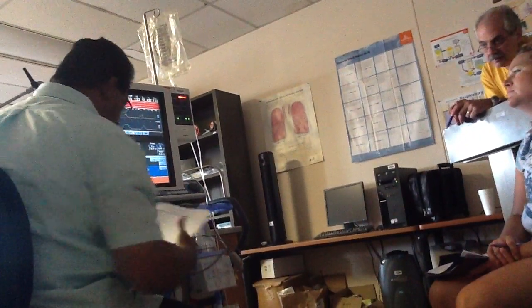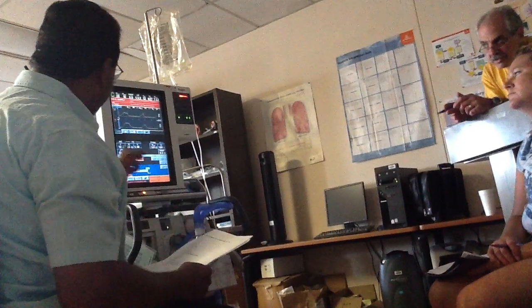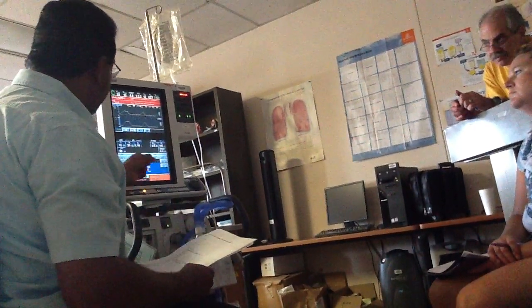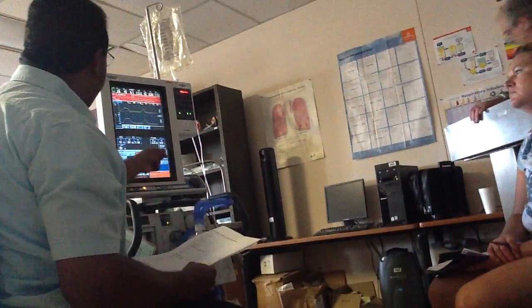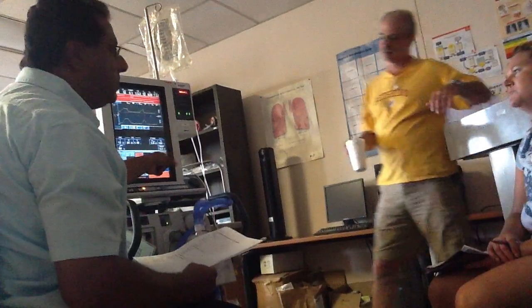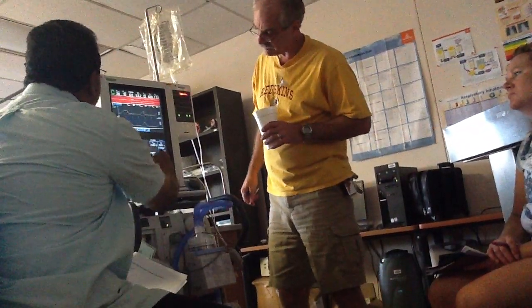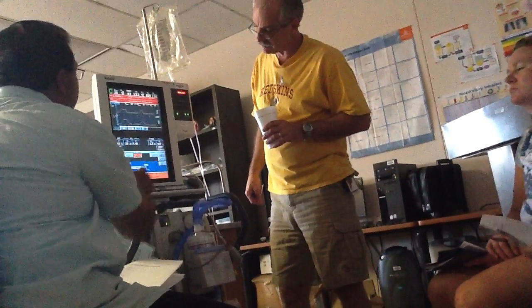Now, what is the next one? So you did the respiratory rate, you did the sensitivity, the pressure. You already adjusted the IE ratio, which is locked to 1 to 4, and your FiO2 is already 100%. Your PEEP is 5. Is it still 5? Or where are we at? We're still on 5.